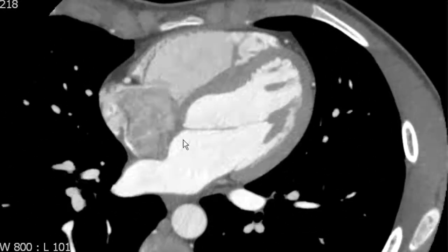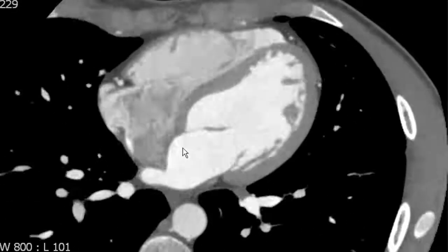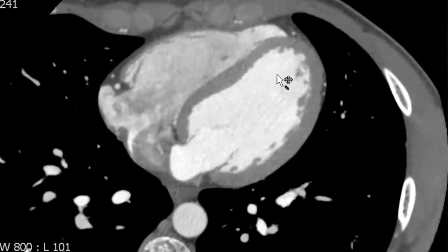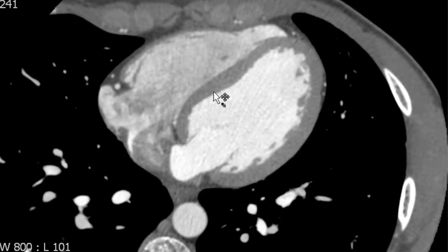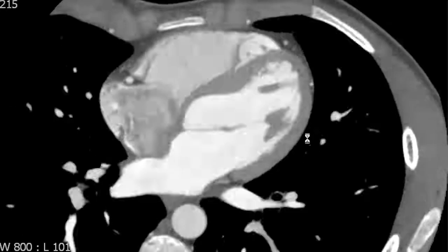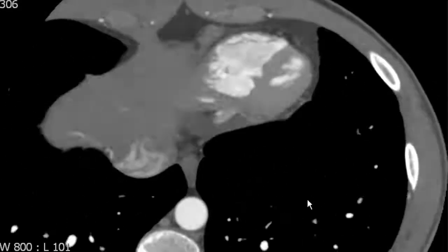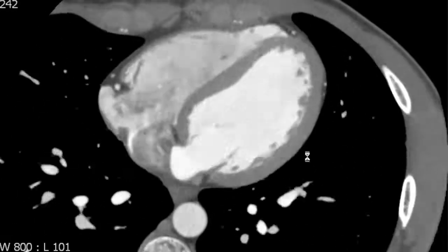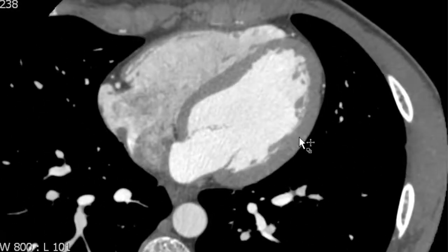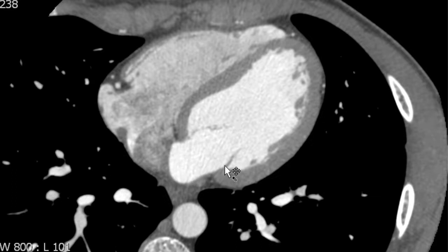The right ventricle is separated from the next chamber by a muscular interventricular septum, and the next chamber is the left ventricle. We can see the left ventricle on the left side of the heart, separated from the left atrium by the mitral valve.